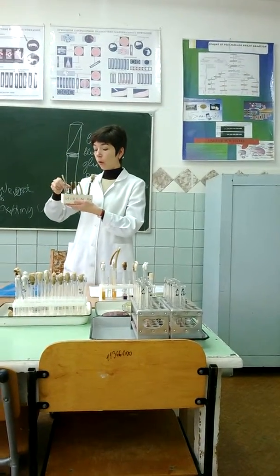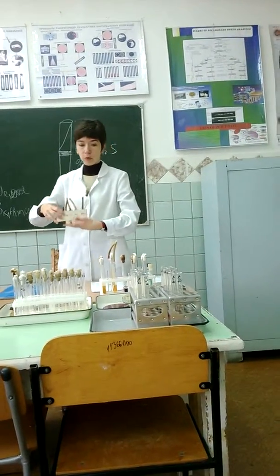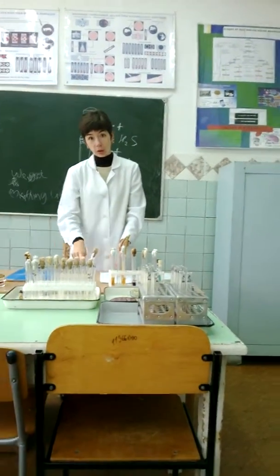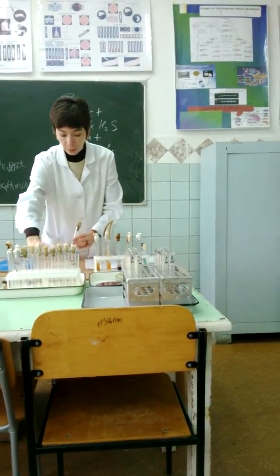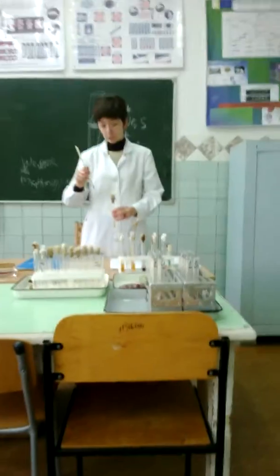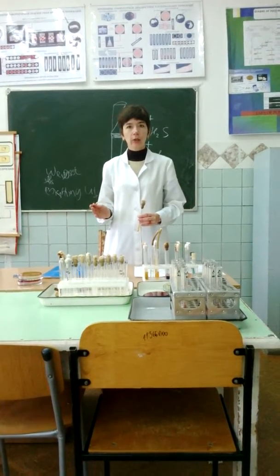There are sera for antigens O9, O12, and for others. What do you do? You take a slide, add a drop of each serum to the slide. Then flame and burn the bacteriological loop, take bacteria and add to each of these drops and spread. Sterilize the loop, take the next portion of culture, and spread. After 2 minutes, you may read results.